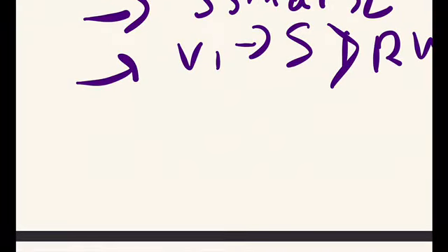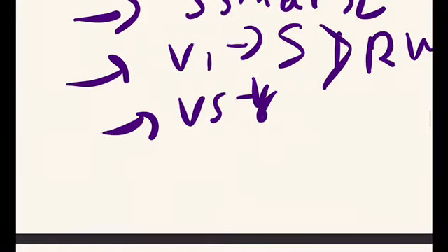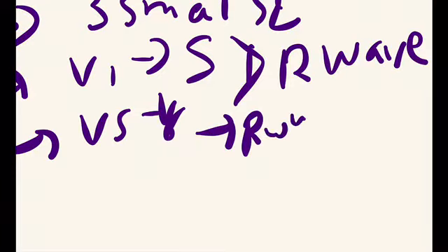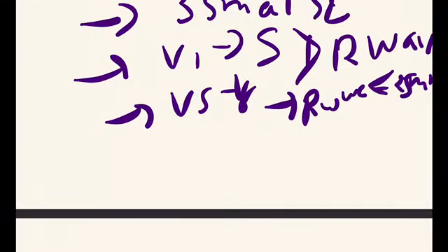Now talking about the left ventricular leads, like V5 and V6, the height of the R wave should be less than 25 millimeter. So this was about V5 and V6.